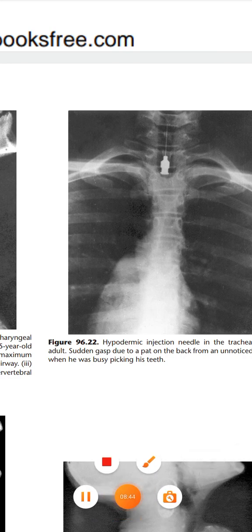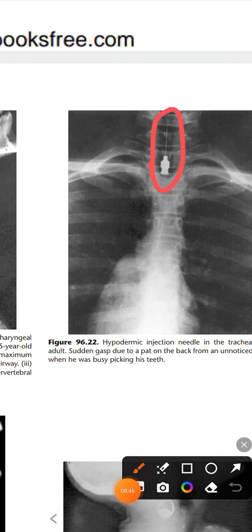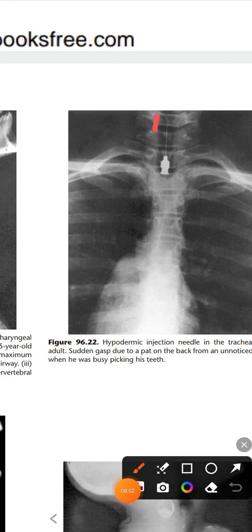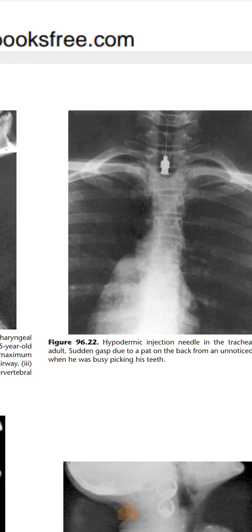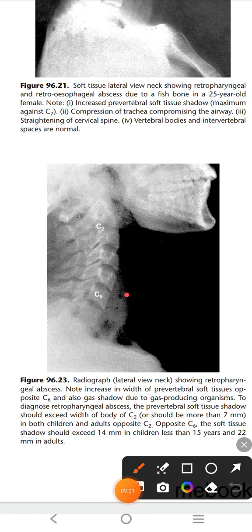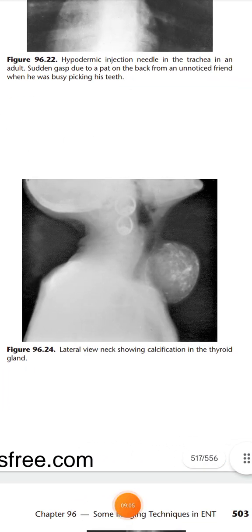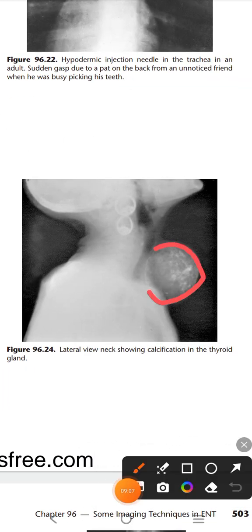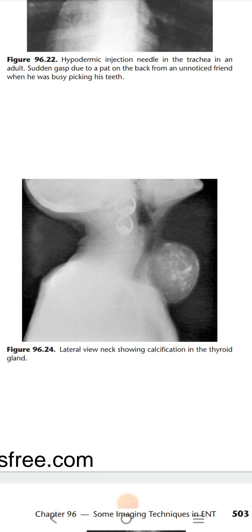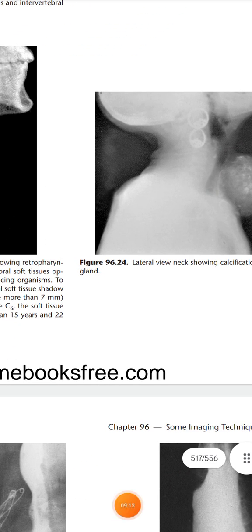Here you can see a hypodermic injection needle in the trachea, as the trachea is visible from the previous video. And here again the pre-vertebral shadow has been increased — you can see this is a thyroidal mass with some calcifications present inside it. That was all for today, thank you very much.